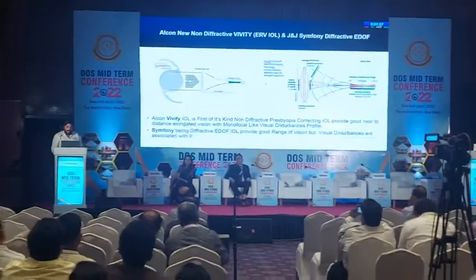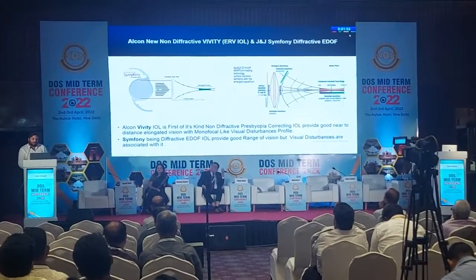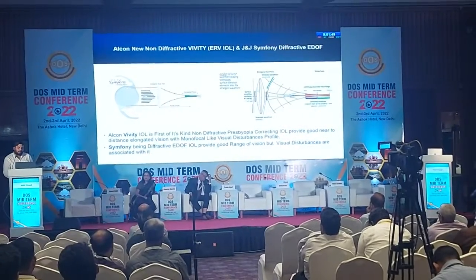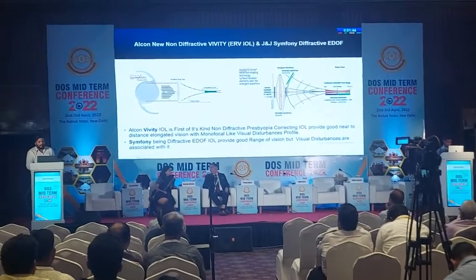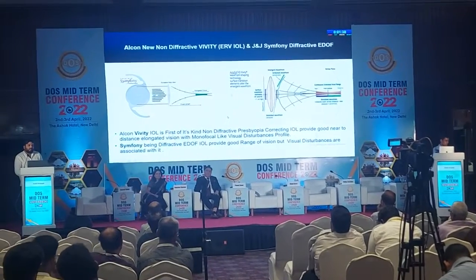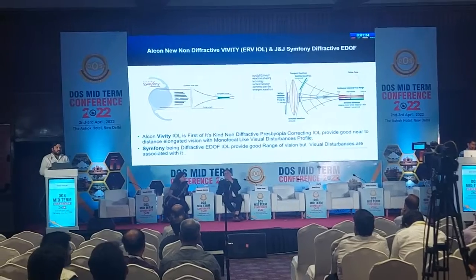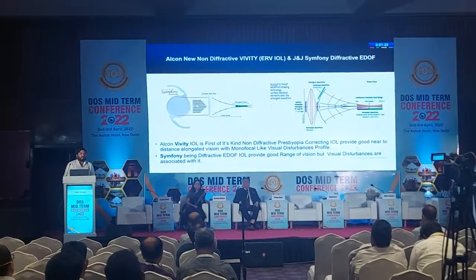Sir has already covered the Vivity IOL, so this slide just shows the wavefront shaping. It's the central 2.2 mm of the optic, which delays the wavefront and creates this elongation, which gives the extended depth. One learning with EDOF lenses, after having implanted many EDOF lenses on various platforms, is that I think we need to promise less when it comes to near.